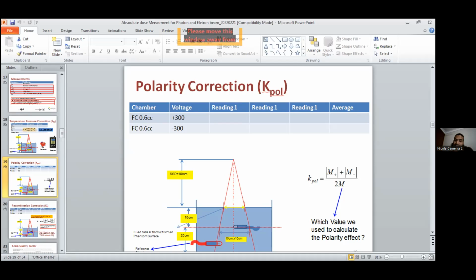No, exactly. The drift velocity, because the mass of the electron is much, much lesser than the positive ions. That makes sense? Yes, yes. Okay, and you explained it beautifully. Yeah, that's the main point. That's why you have to correct it for both plus 300 and minus 300.